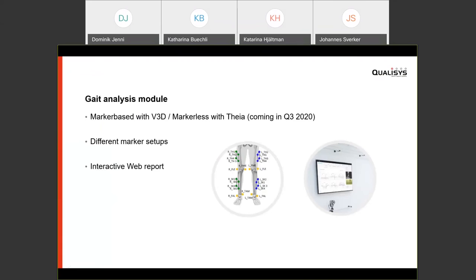Qualisys has different analysis modules for organizing captures. The gait analysis module is marker-based with Visual3D for analysis. Coming in Q3, a markerless version will be included in the same module together with the Theia integration. The gait analysis module supports many different marker setups and includes an interactive web report.